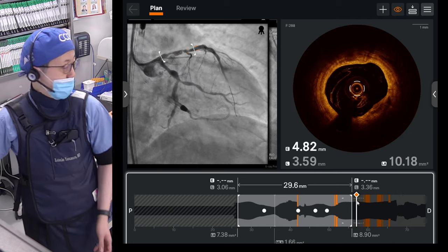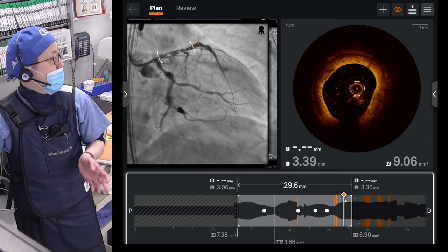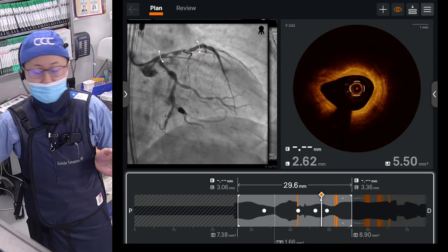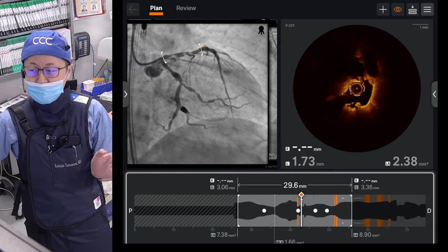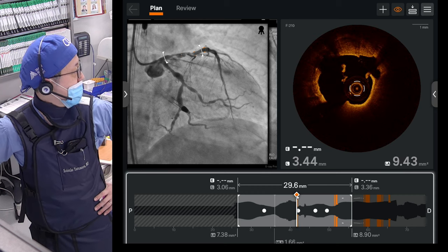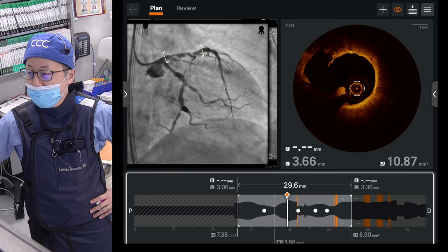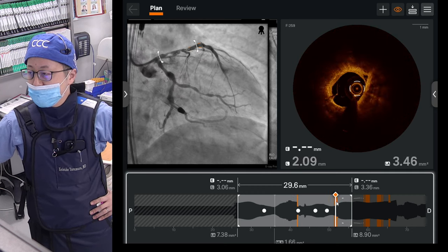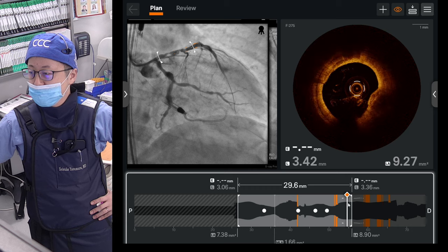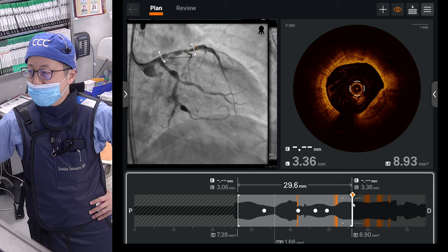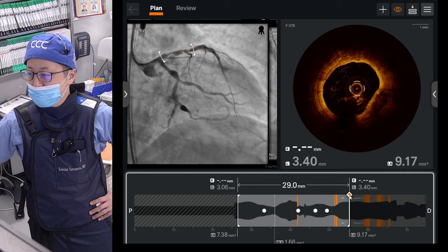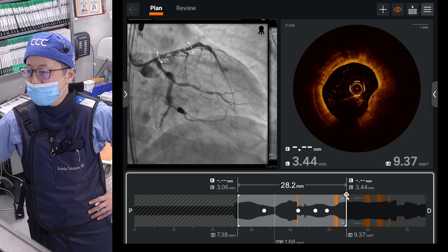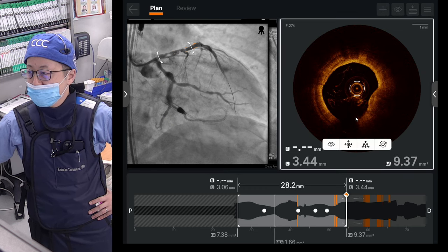As you noted, the calcium is not obstructive. Our tightest lesion is not calcific. As angiographically felt, there is some calcium in that ectatic area, but no obstruction at that level. Earlier there was an ulcerated ruptured plaque.